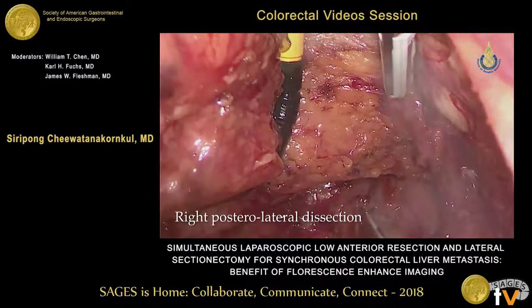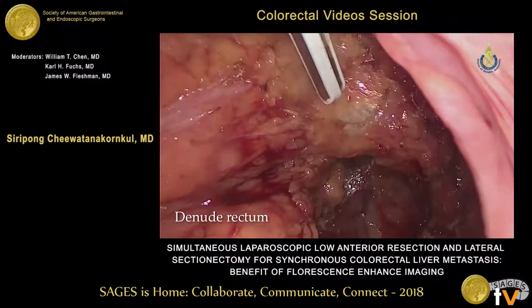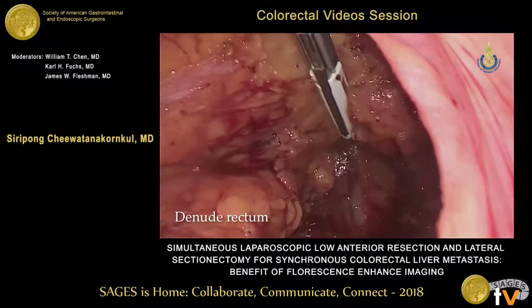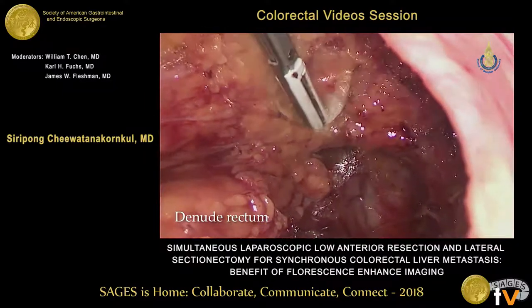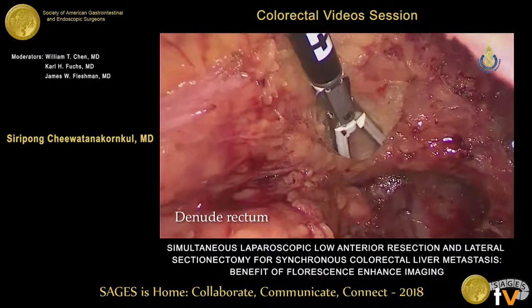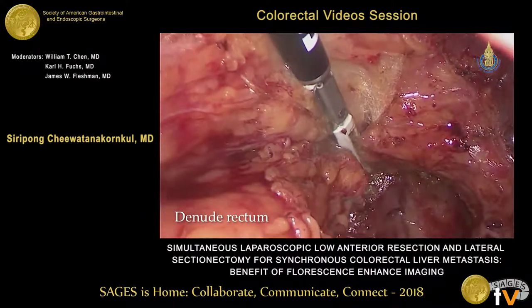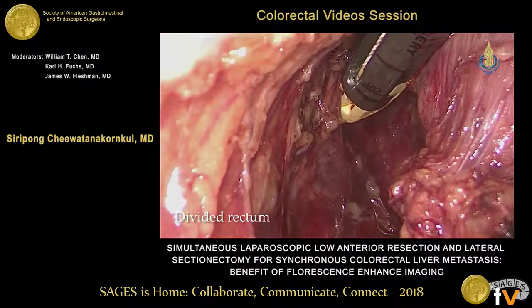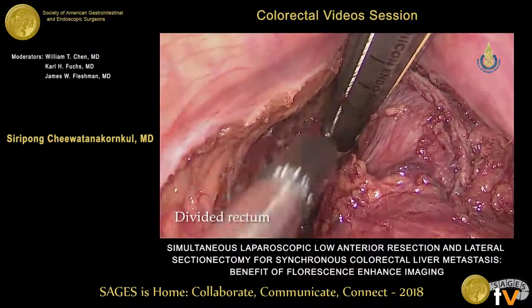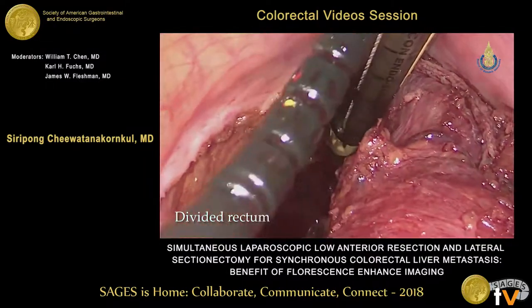We denude the rectum with the vessel sealing device. The trick is that you have to pull the rectum outward and put tension on it, and then you can do the dissection. After denuding the rectum, we introduce the endo-GIA through the suprapubic port and then cut it. I use gold load. We use one or two cartridges. If you can clear the rectum well enough, sometimes you can use only one load.